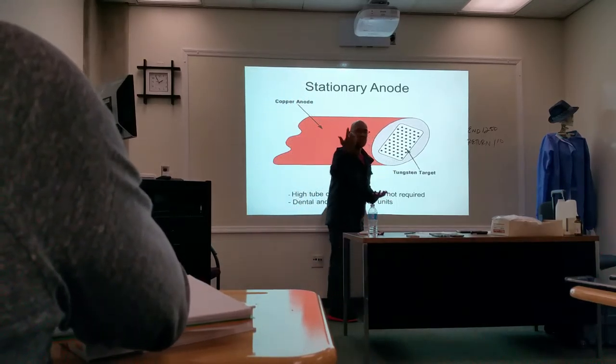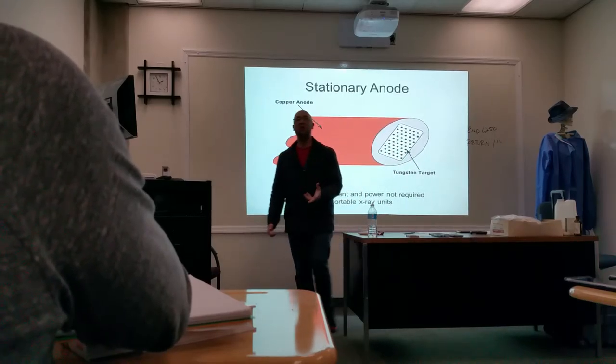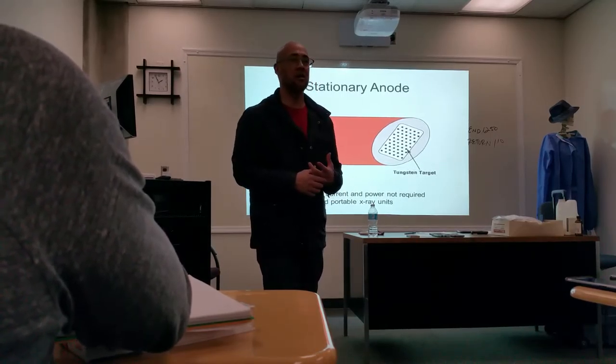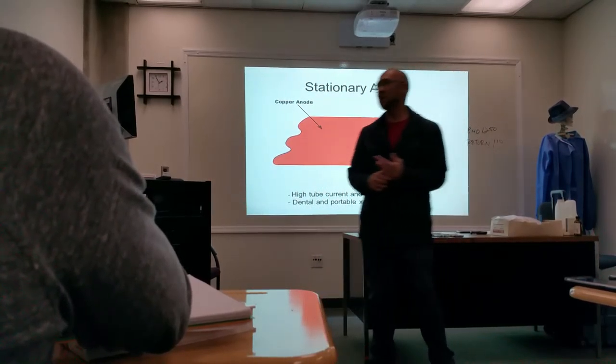With the higher energies we're talking about, if it continues to hit the same area of the target over and over again, eventually it is going to cause that divot. This is known as pitting. P-I-T-T-I-N-G.